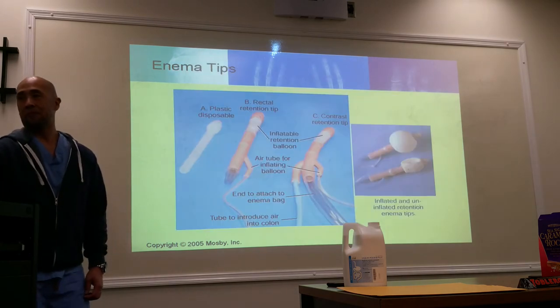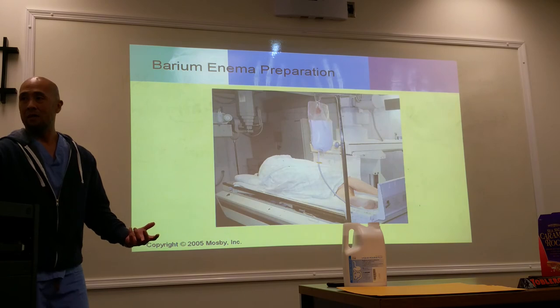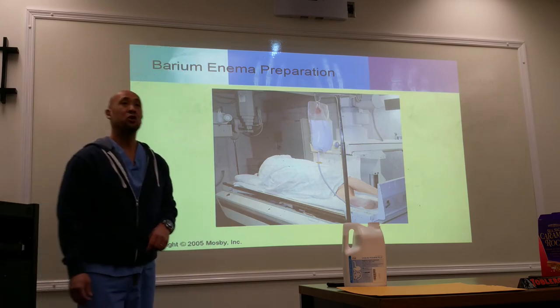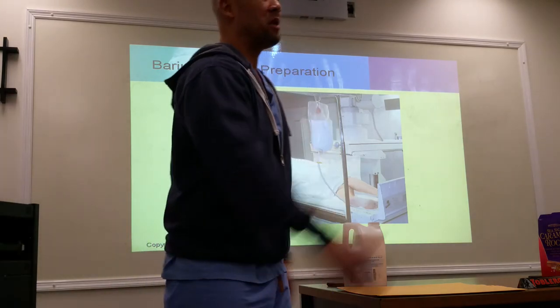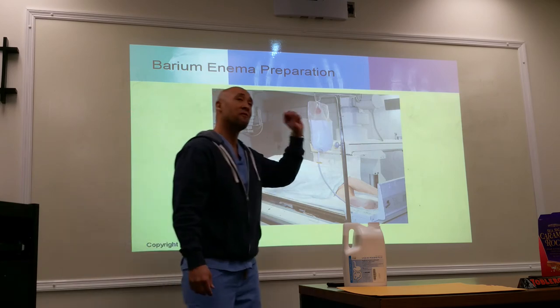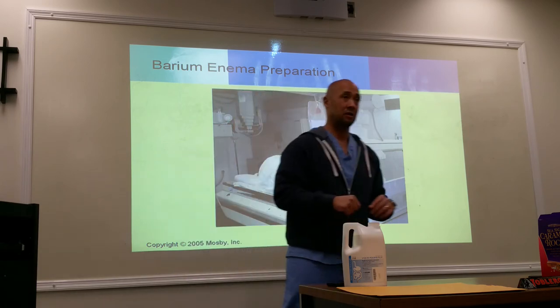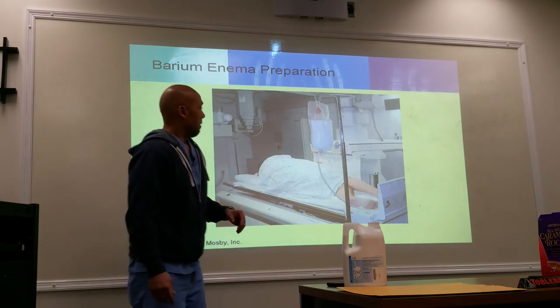All right, so those are the different tips. This is the basic setup of doing a barium enema. You don't put that tip in there until they are ready to go. Another protocol that may differ from hospital to hospital is that you're not inflating that balloon until the doctor comes in. But most places will have you inflate that balloon before the doctor comes in to do the fluoroscopic portion of it. So again, follow whatever the protocol is. You guys understand that? Okay.